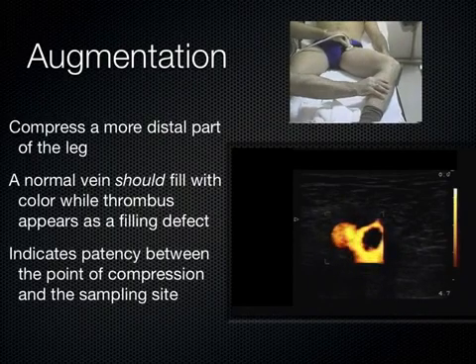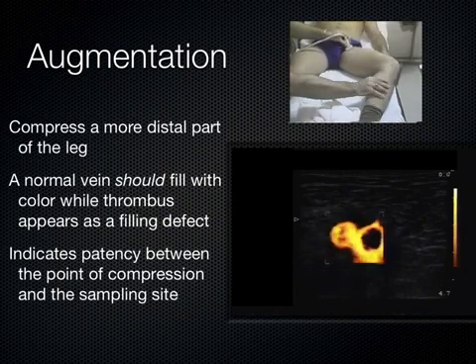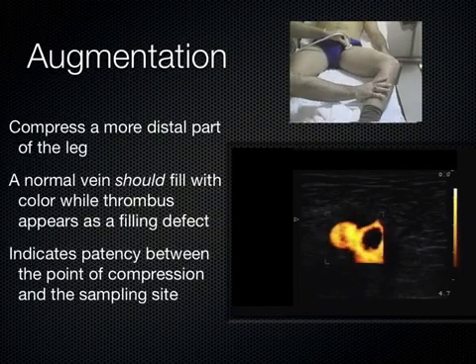I like to teach it to medical students because it gets you involved more with Doppler and color, gets you thinking about that, outlines the vasculature, and you'll see it's kind of fun to do today when you go to practice it. You'll squeeze the calf and you'll see a big blush of flow come back either in the pop or the fem. That's kind of fun to do. So make sure you do that today.